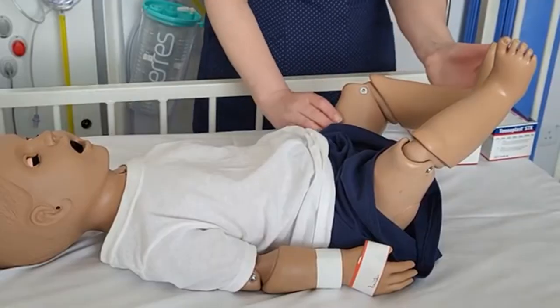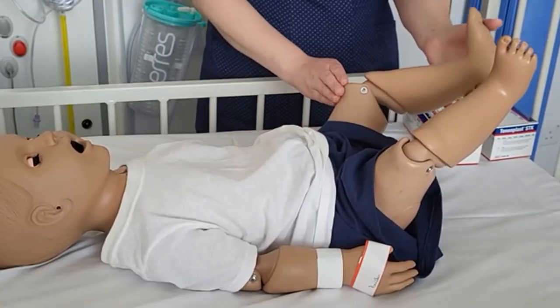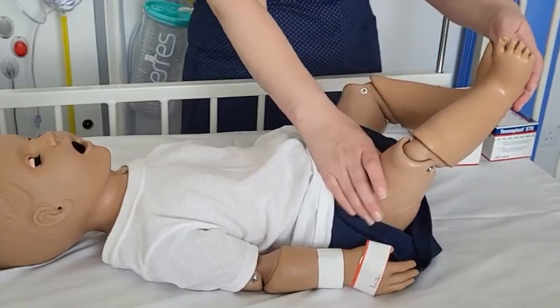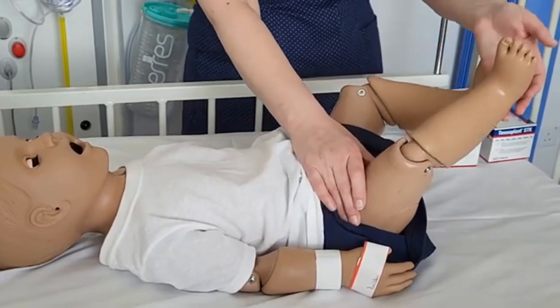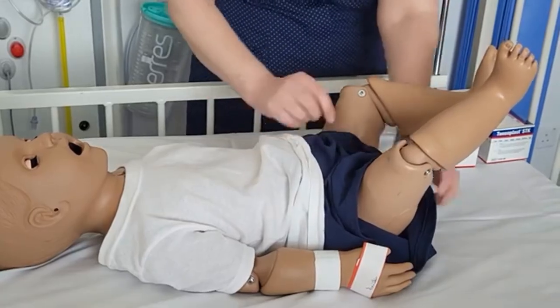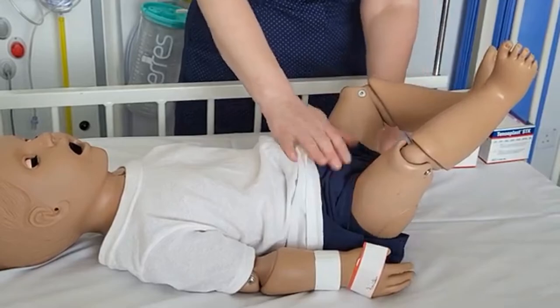We examine the legs to make sure they are clean and the skin is all intact. Ensure that you've removed any clothing so that you can get to all of the skin to apply the traction bandages.